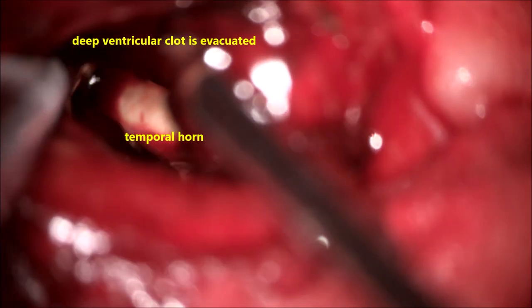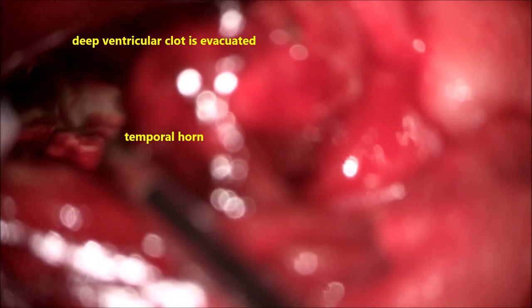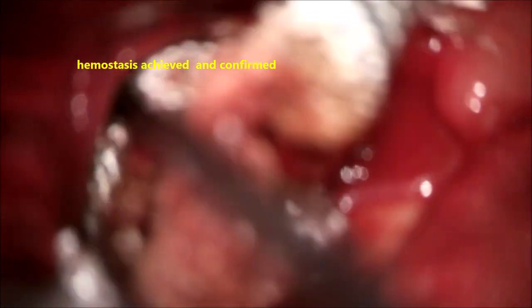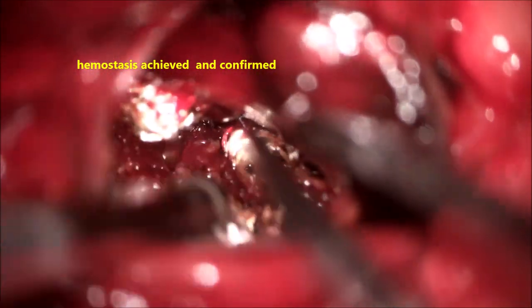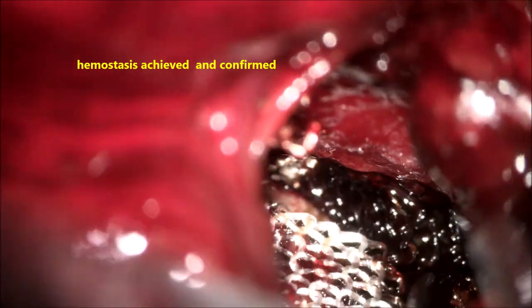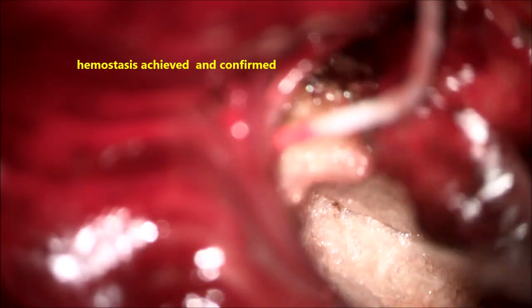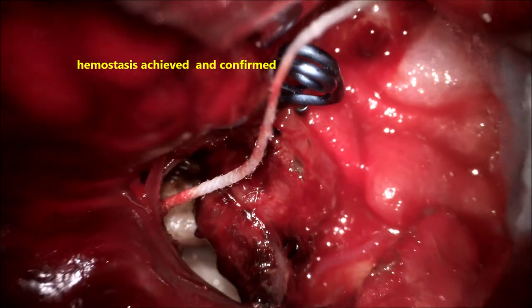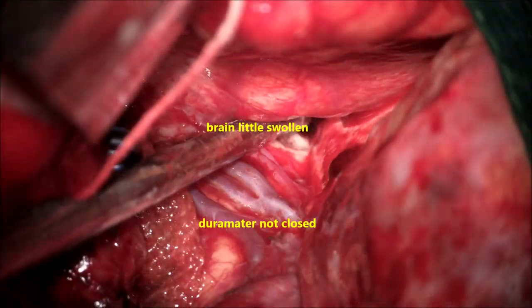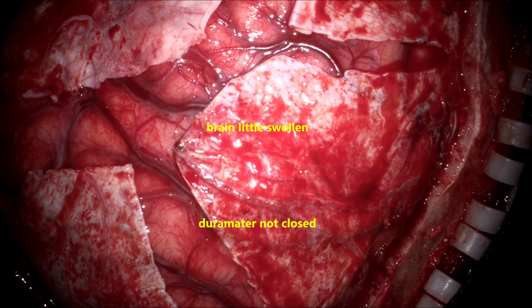We advance deeper into the temporal horn of the lateral ventricle where clot is present. The clot is gently removed to restore good CSF flow and circulation within the ventricle. The deeper portion of the hematoma is evacuated as far as safely accessible to reduce clot burden and mass effect, which is important for reducing subsequent brain edema. Hemostasis is then achieved and confirmed by waiting 10–15 minutes with elevated blood pressure to verify no oozing in the clot bed. The dura is not closed because the brain is tense and swollen; the bone flap is replaced and the scalp is closed.